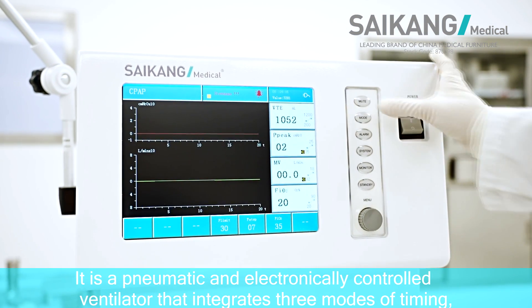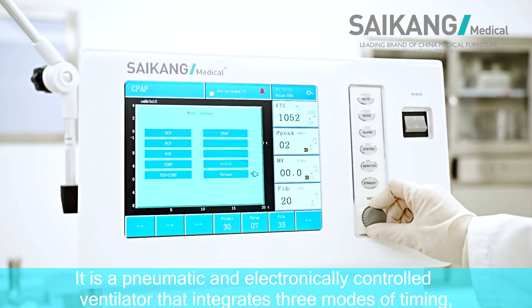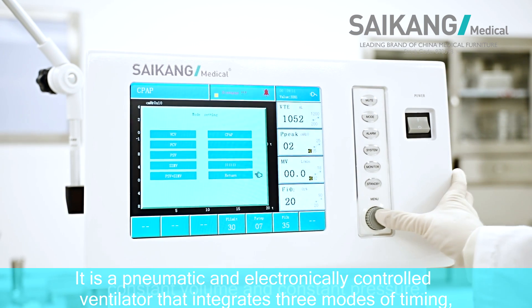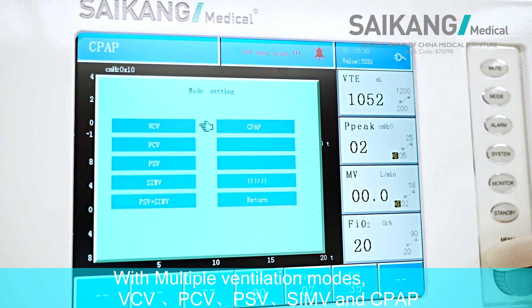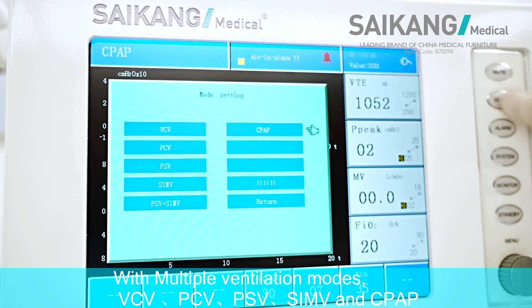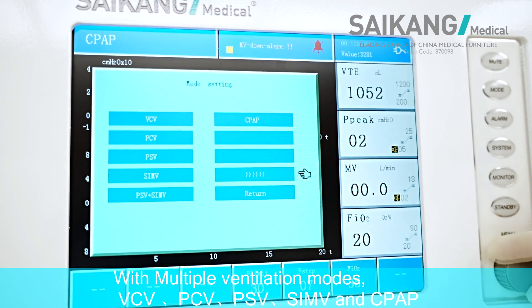It is a pneumatic and electronically controlled ventilator that integrates three modes of timing, constant volume, and constant pressure, with multiple ventilation modes: VCV, PCV, PSV, SIMV, and CPAP.